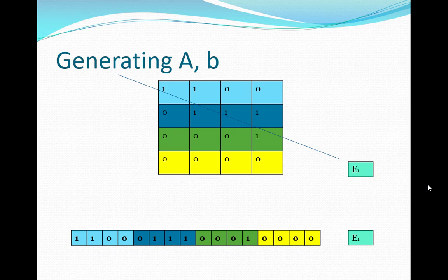They take volumes of water and pass protons through them, because it's not just us who use this; nuclear physicists use it, all kinds of people. So the water equivalent path is a really important standard. It has been studied to the umpteenth degree. We don't need to measure it or guess it; there is an exact one. So we just store that data table. We take that energy and look it up. There's a fit polynomial, like 5th and 7th order polynomial fits, and we take those energies and figure out the water equivalent path.